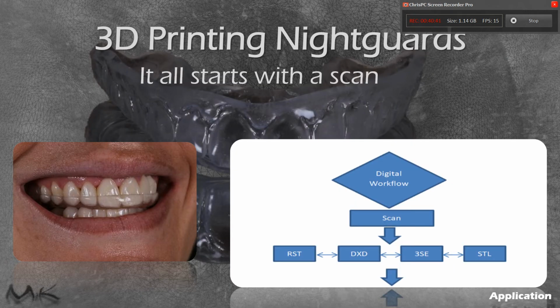One of the easiest ways to introduce this, in my opinion, in your practice is the 3D night guard. And it all starts with your scan, right?